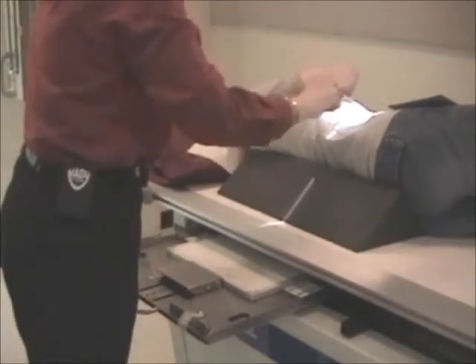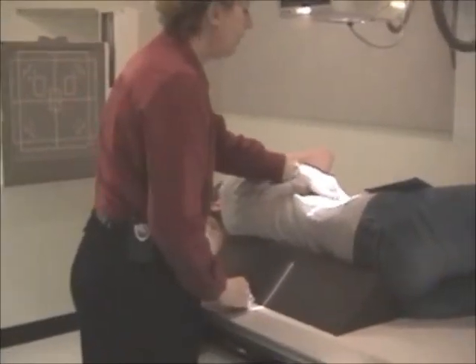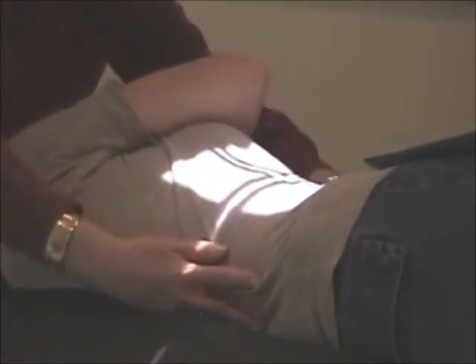Fix your field size. And the xiphoid again. Find the xiphoid. And I'm going to be 2 inches below the xiphoid and approximately 2 inches to the right of the xiphoid. I'm going to look at the patient, and I'm going to see that it's centered. Her body is centered to the frame. I don't know if the camera can look at this angle. The reference again is 2 inches below and 2 inches to the right of the xiphoid.